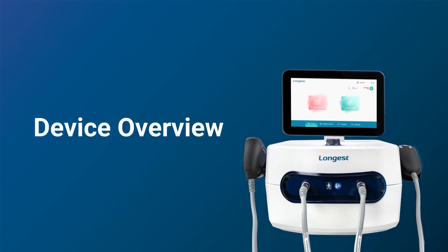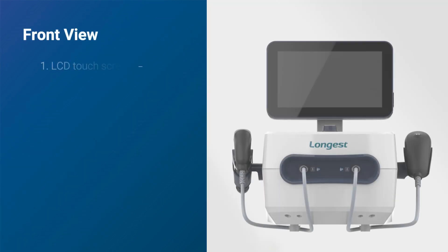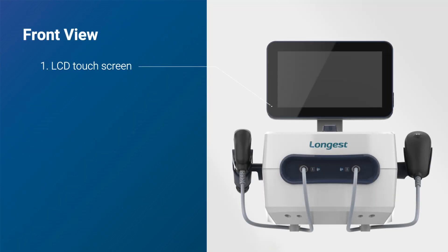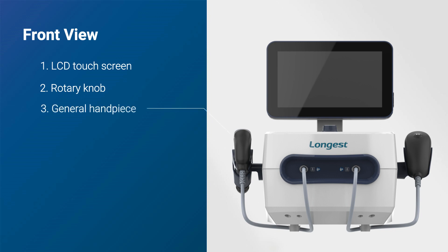Let's start by familiarizing ourselves with the structure of the device. This is the front view of the device, with a large LCD touchscreen, a rotary knob, and USB port.